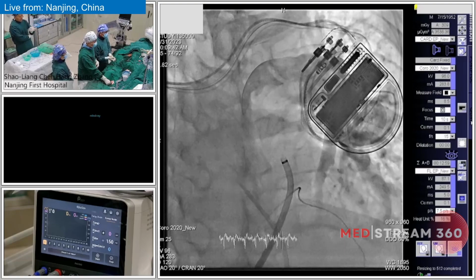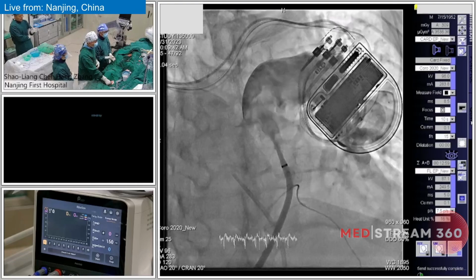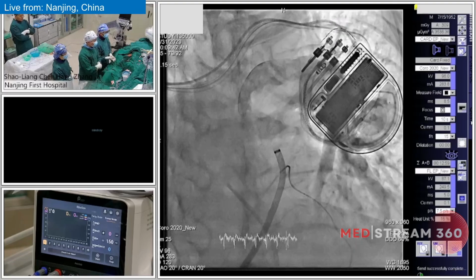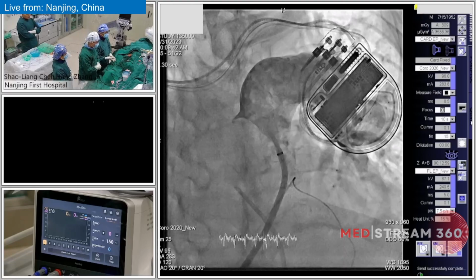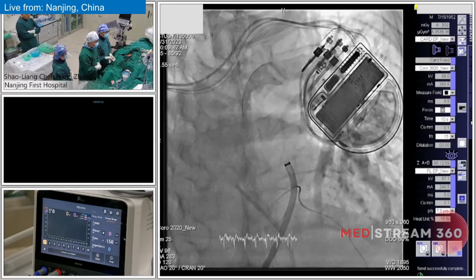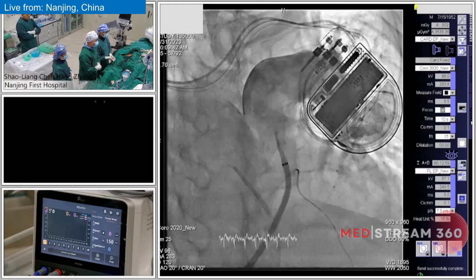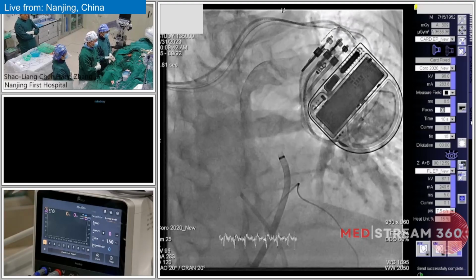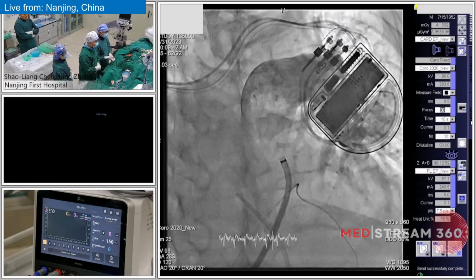After pulmonary artery denervation, I think these are very important injections to confirm the bifurcation area between the left and right branch, and it will be very useful to guide the ablation site. According to our animal study and autopsy, the sympathetic nerves of the main trunk of the pulmonary artery are localized at the left lateral wall.